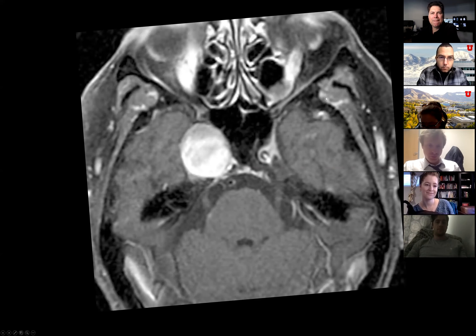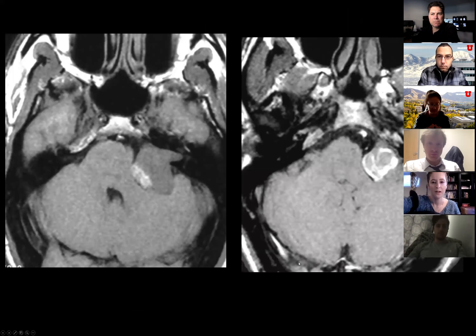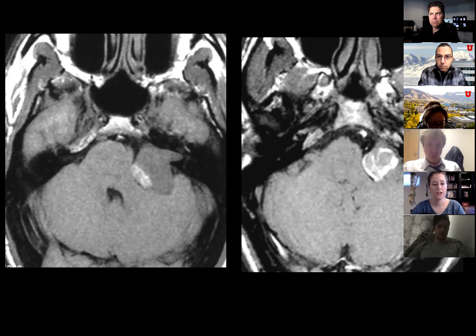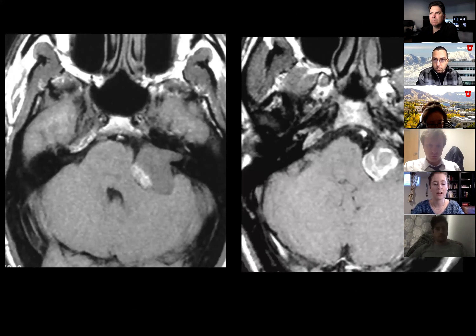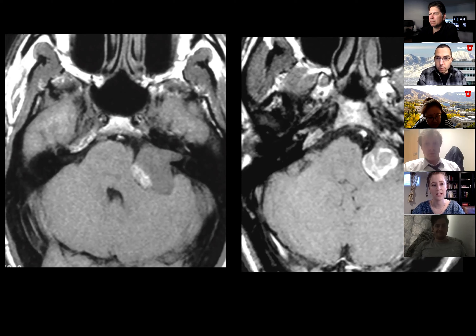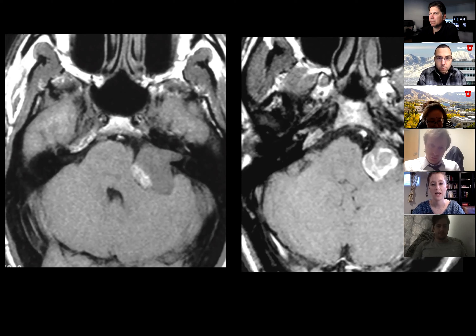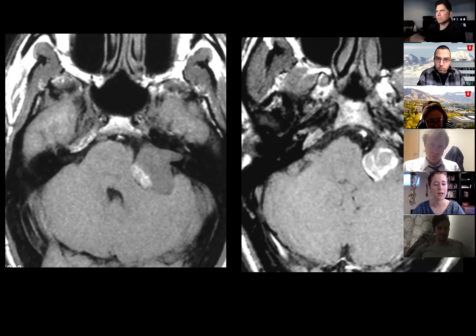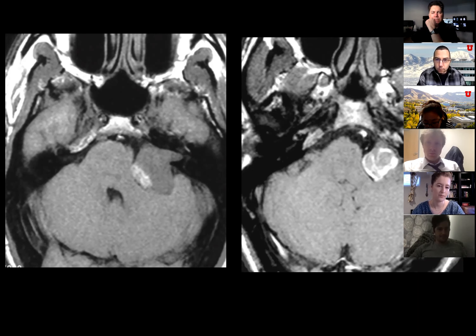We have two images through the CPA — T1 non-contrast-enhanced images, probably at different levels. There is a predominantly isodense-to-brain lesion expanding the internal auditory canal with some intrinsic T1 signal intensity within it. My top diagnosis would be a vestibular schwannoma.